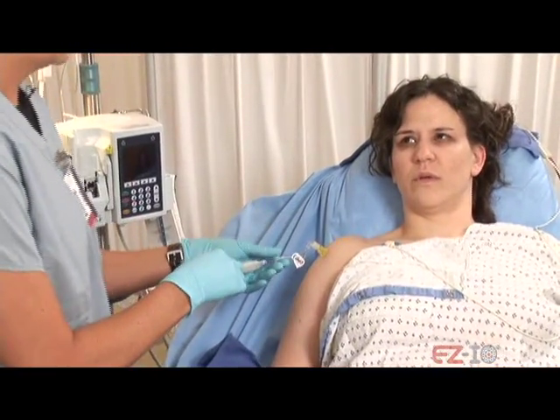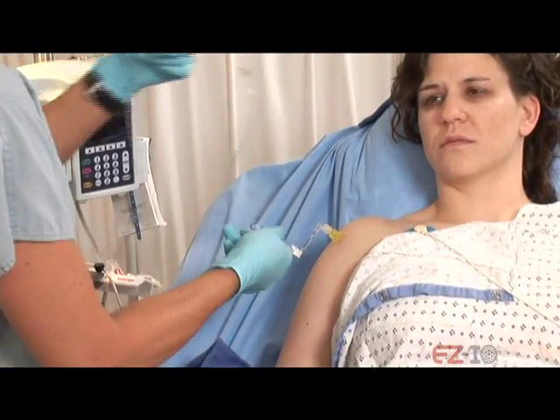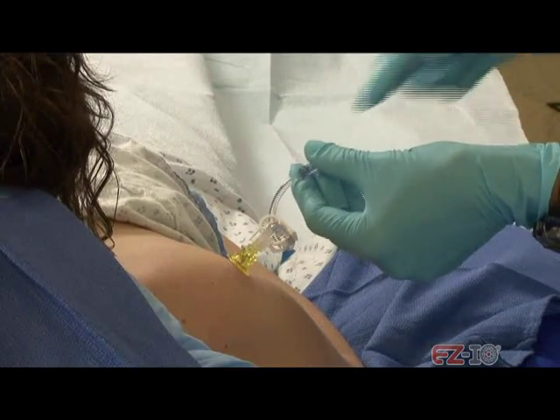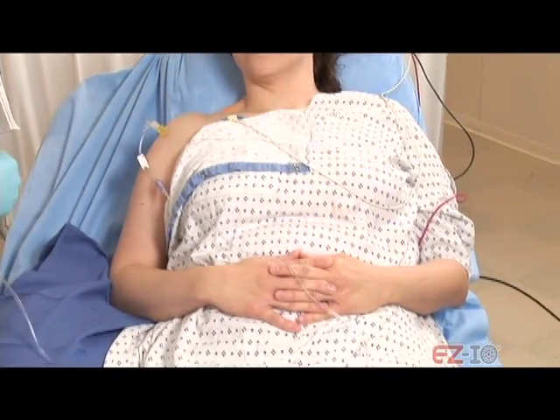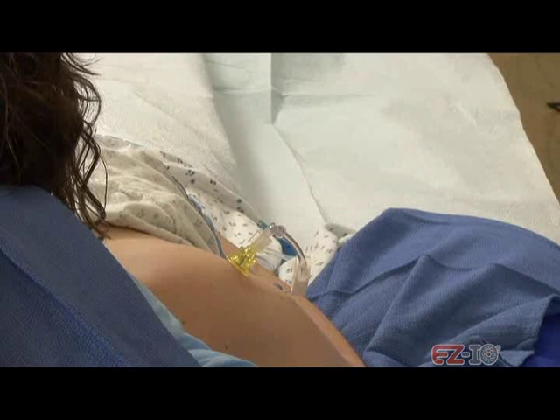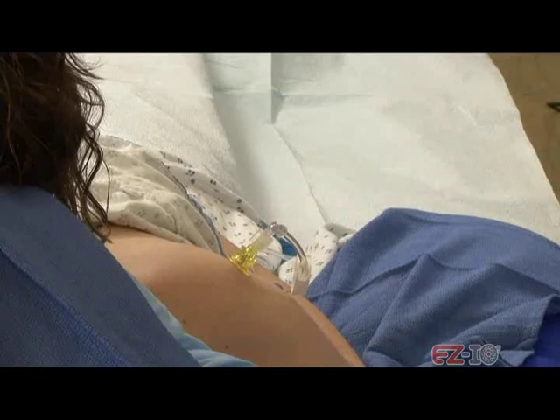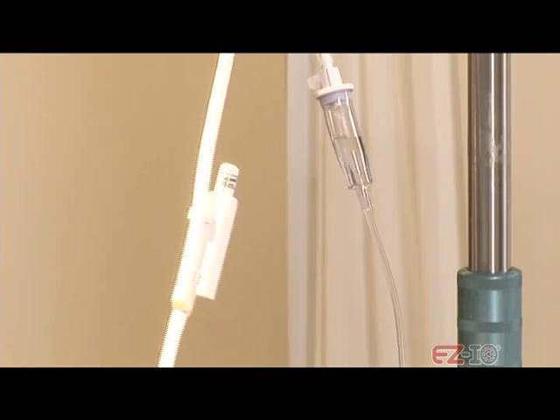What's your pain level at now? Probably like a 1 or 2. Great. So now I'm just going to hook this up to our IV tubing, and that's going to run the rest of that medication in. The pressure in the medullary space is approximately one-third of the patient's mean arterial pressure — fluids or medications must be delivered under pressure to obtain maximum flow rates. Rapid fluid infusers can be used for aggressive fluid resuscitation. I'm just putting a little pressure on that fluid. Still doing okay? Yeah, it's a little pressure but it's tolerable.